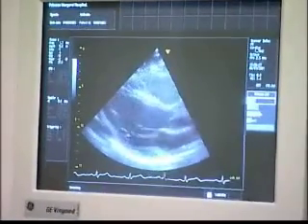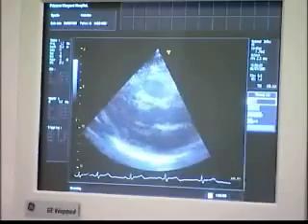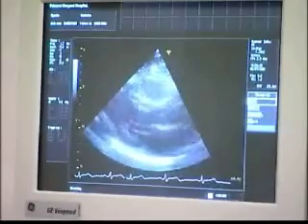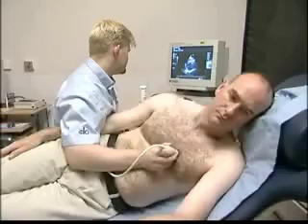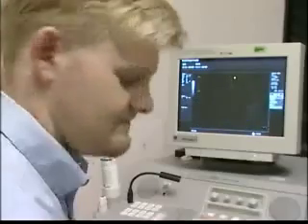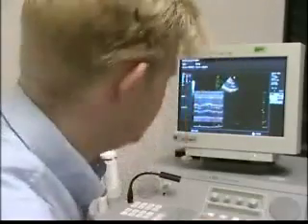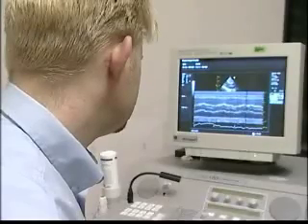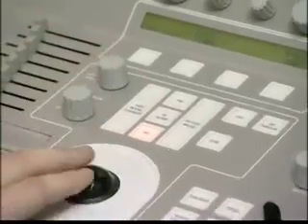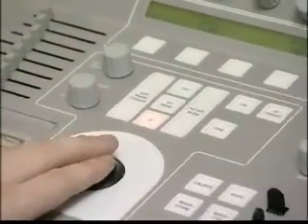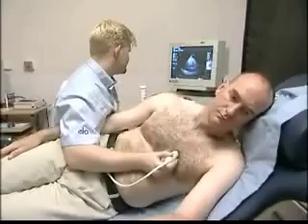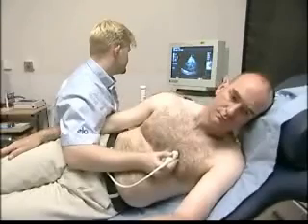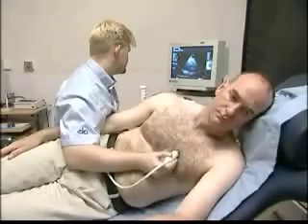Paul has produced a parasternal view of the heart, first showing a standard B-mode image. He then selects a direction from the B-mode image to examine in M-mode, which allows the position of different parts of the heart to be plotted against time. Moving into colour Doppler mode, the blood flow through the heart can be visualised.